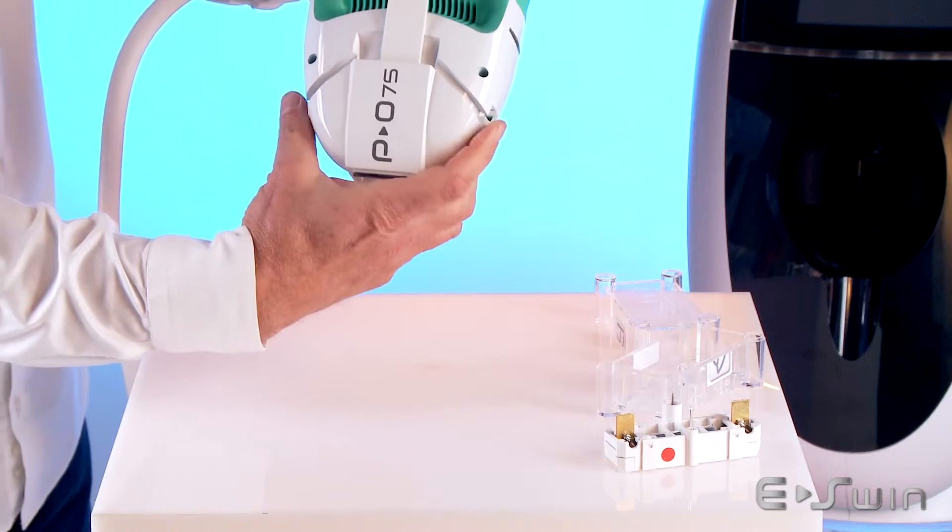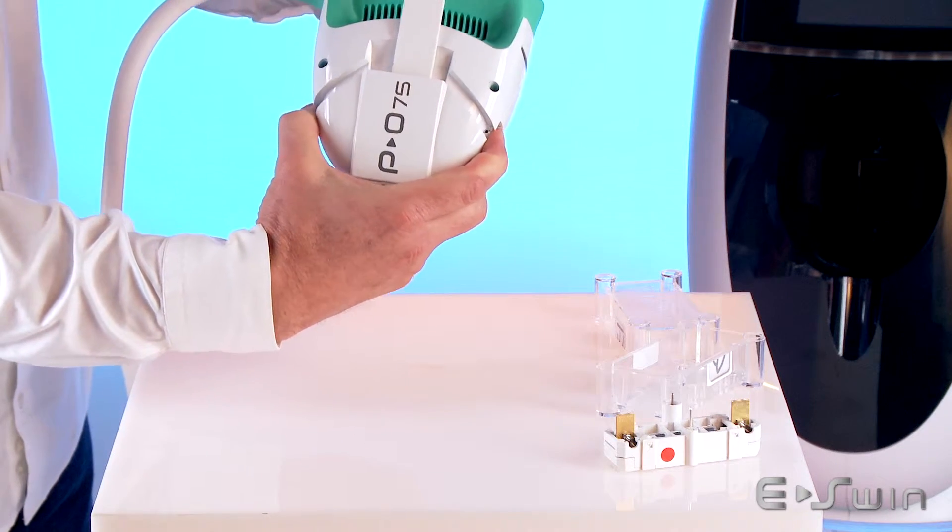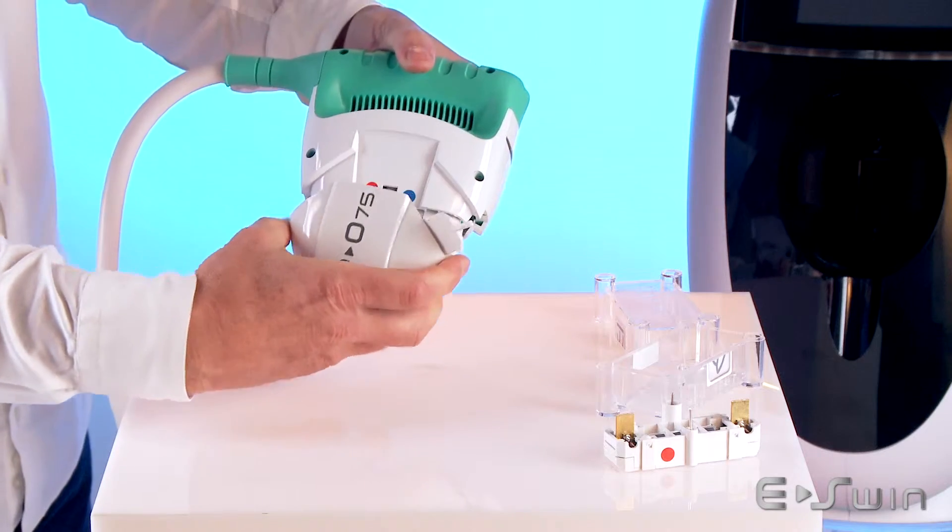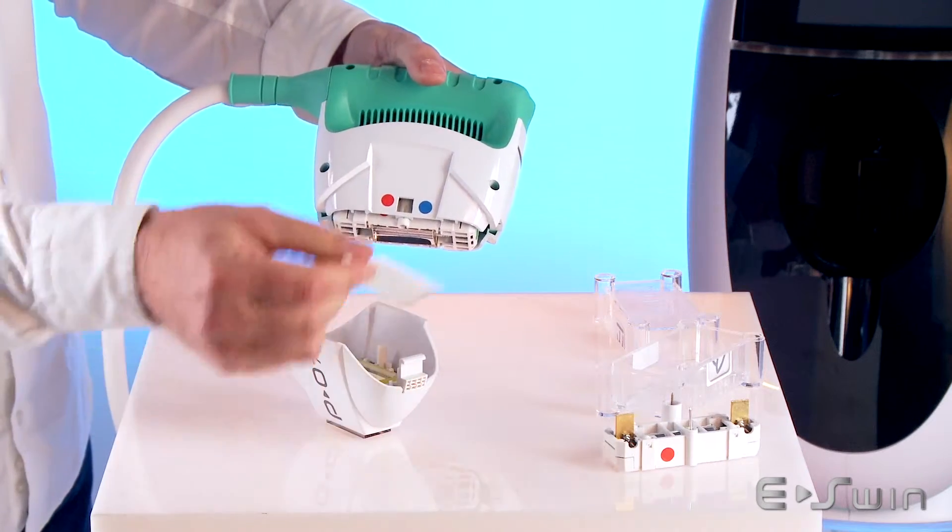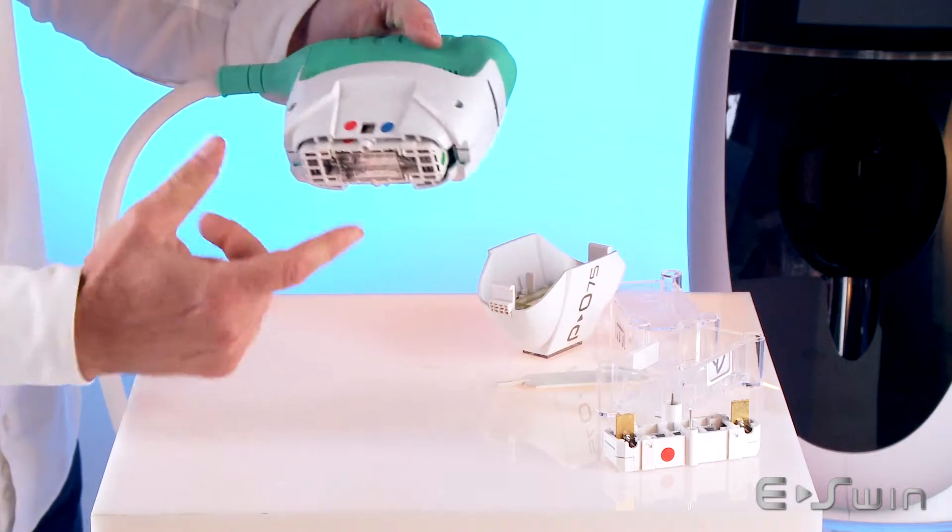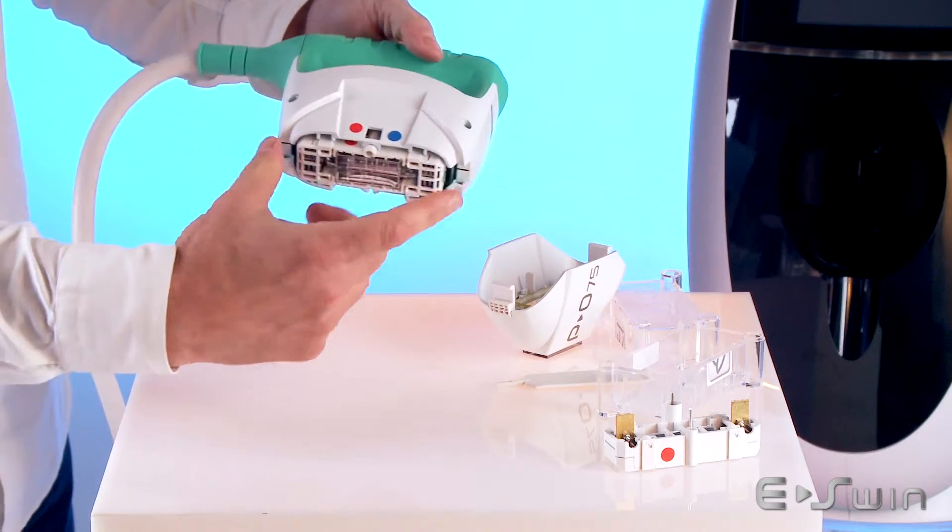Press simultaneously on the two locking tabs that hold the mobile head and remove the mobile head. Hold the cartridge at both ends and carefully take it off.